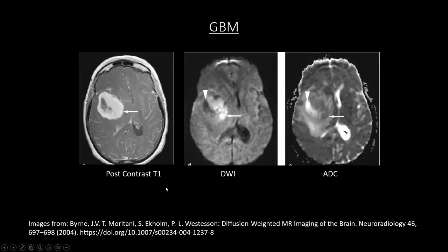Again, this is a case of glioma in the right temporal lobe. You can see the post-contrast T1-weighted image showing heterogeneous enhancement. Diffusion-weighted imaging showing hyperintensity in some portion, and the corresponding ADC map shows decreased ADC. And also some hyperintensity in the cystic areas. So, this actually clearly gives an idea about this particular lesion is having high cellularity and increased diffusivity in the cystic areas.